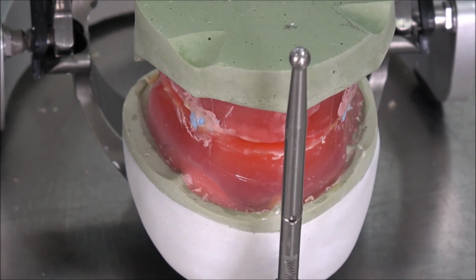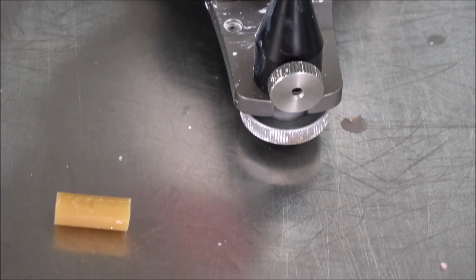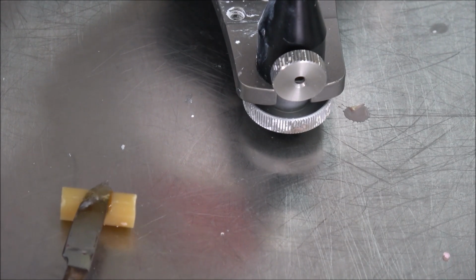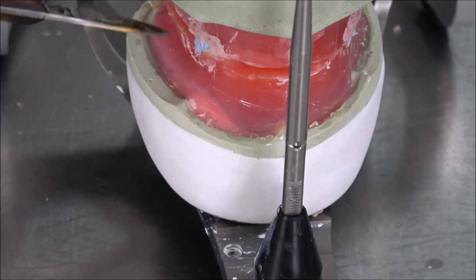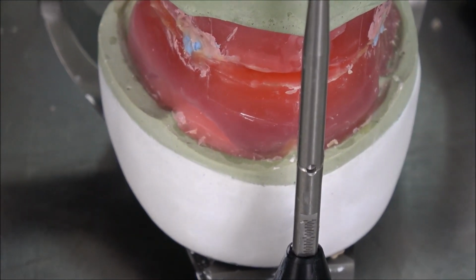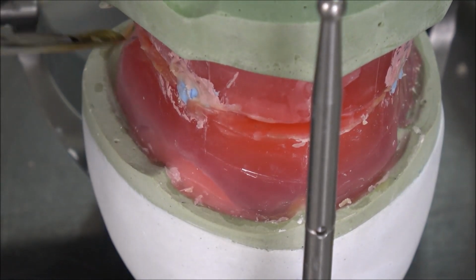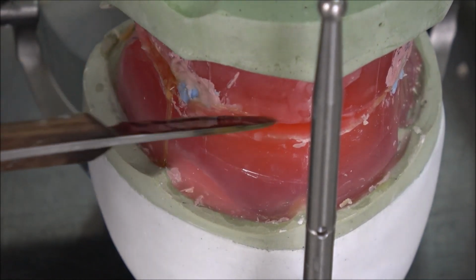Now we are going to use our sticky wax to seal our upper and lower bite. Heat up your wax knife, take some sticky wax and we seal it. We just add on in between. Just add on in between. Seal all around.